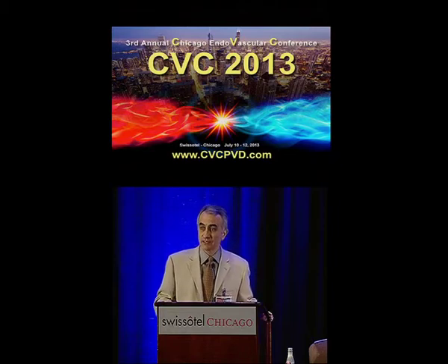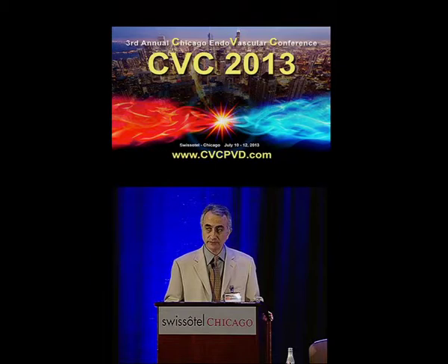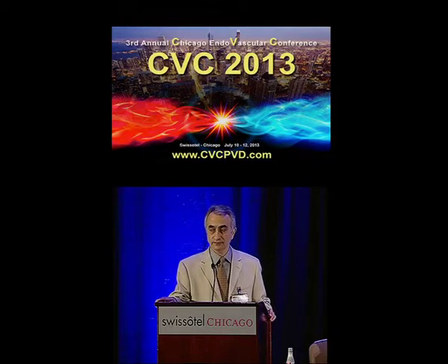Okay. Yes, sir. I have a couple of comments and then a couple of questions. Having done a lot of dialysis work, I've been very disappointed with the results of central vein recannulation procedures, whether with stents or angioplasty or whatever. I've seen a number of stents deployed in thoracic outlets. I just wanted your opinion about why people do that. It's an area that's surgically a no man's land. They tend to fracture frequently. They make the problem a lot worse.